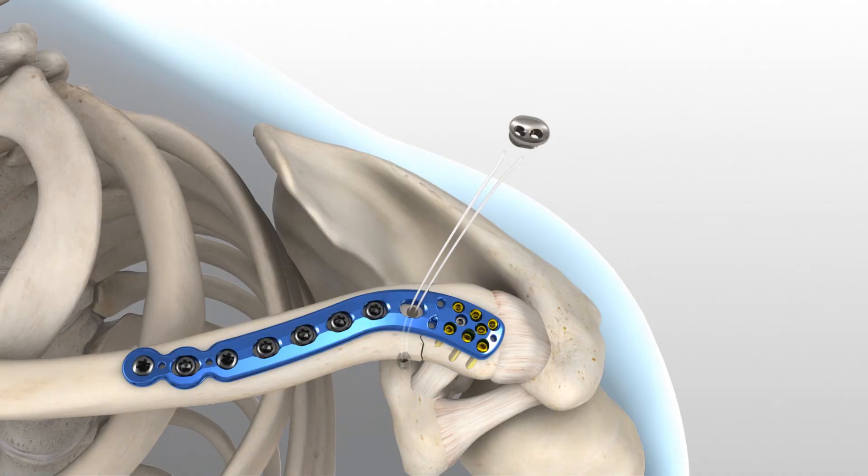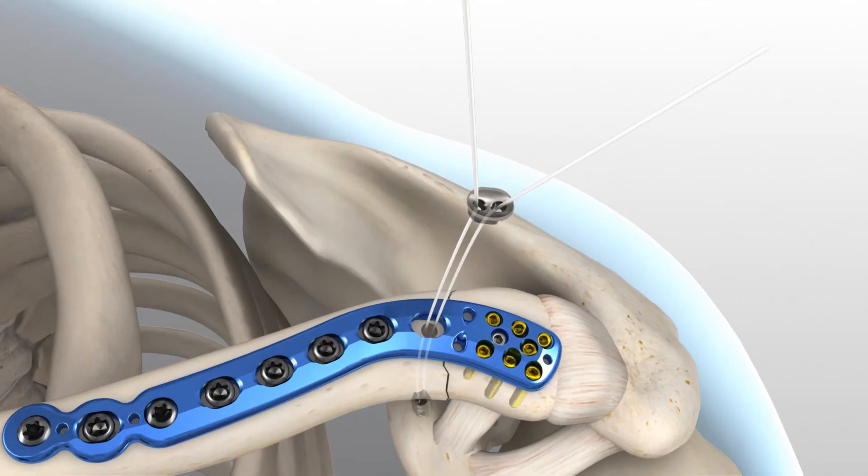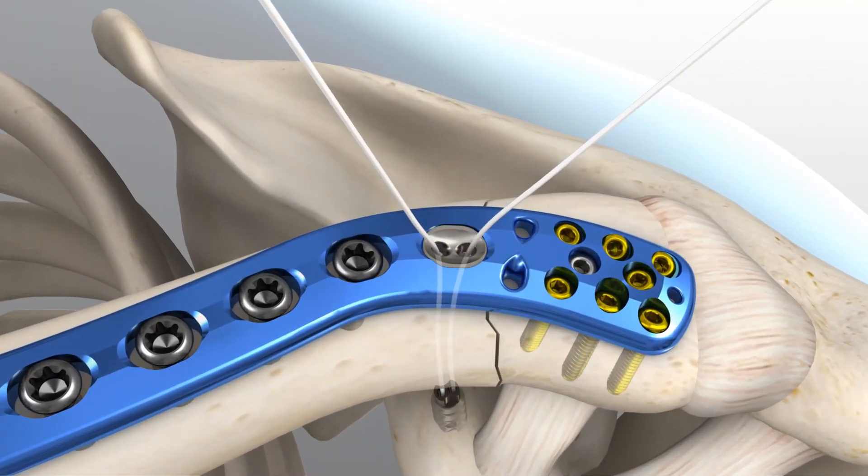Orient the suture retainer with the concave surface facing away from the plate. Pass the suture strand ends through the holes on the flat side of the suture retainer. Slide the suture retainer down into the plate slot to sit flush with the top surface of the plate. Be sure that the suture is not twisted prior to seating the retainer into the plate. After applying the proper amount of tension, secure the suture with a surgeon's knot and at least three additional reversing half hitches. A knot pusher may be required to apply proper tension and to seat the knot down to achieve good knot security.